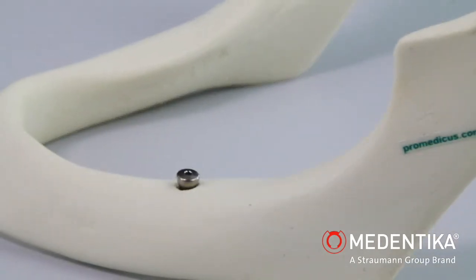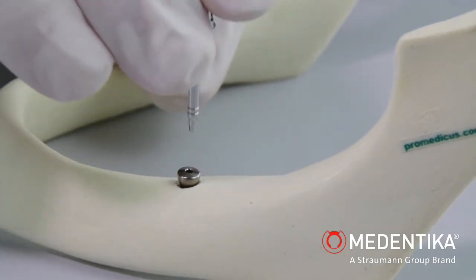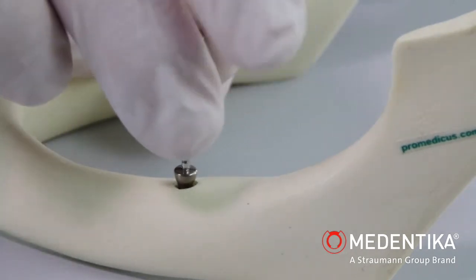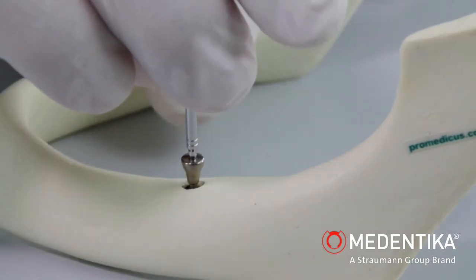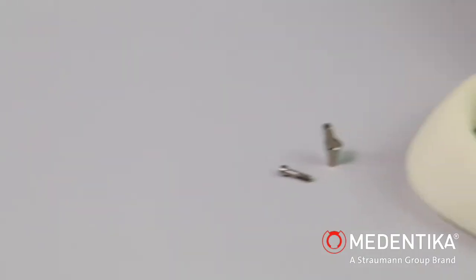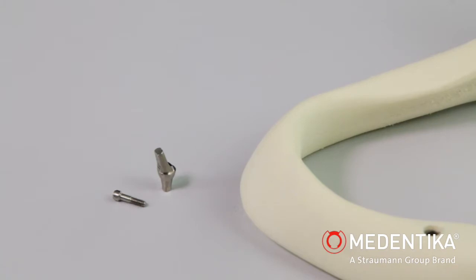The implant is treated prosthetically after the healing phase. The closure screw or gingiva former is removed in accordance with submerged or transgingival healing. The inside of the implant is cleaned and dried using an air-water spray. The abutment is then positioned using a suitable placement tool and ratchet.